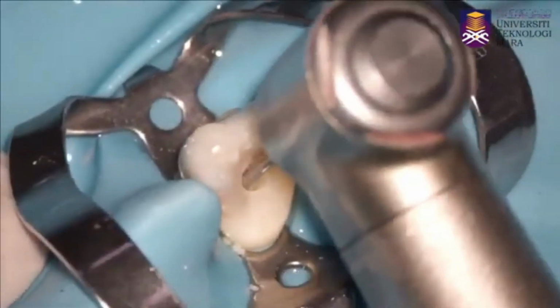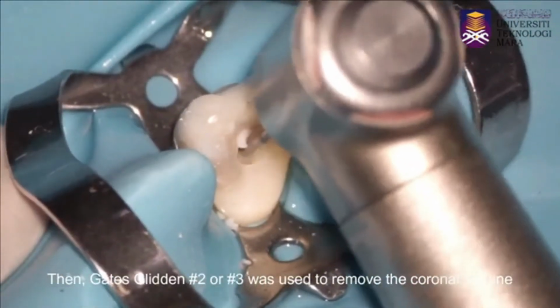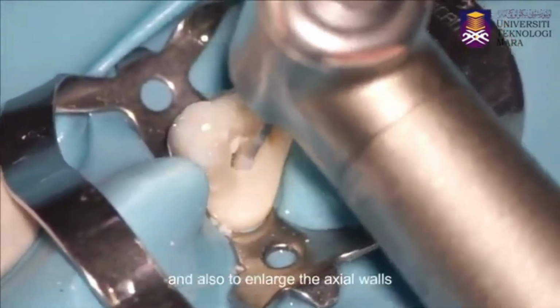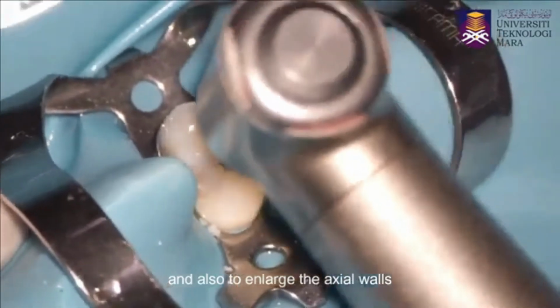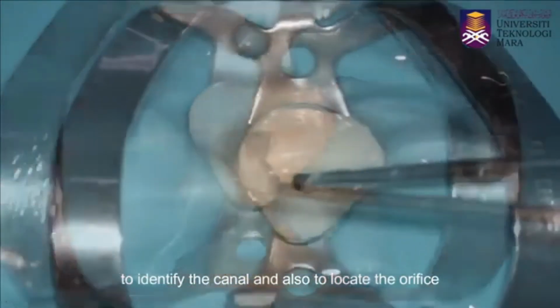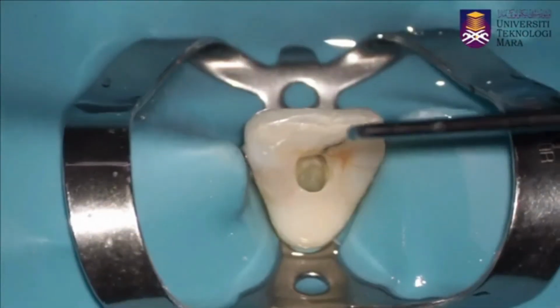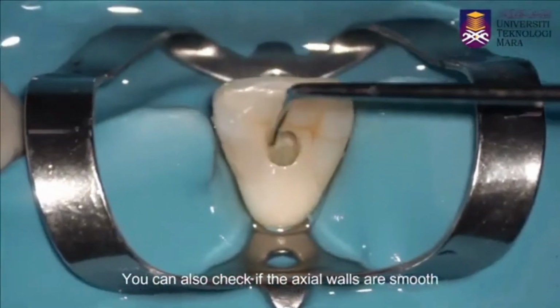The outline form of the access cavity of the maxillary central incisor is a rounded triangular shape with the base facing the incisal aspect. The shape may change from triangular to slightly oval in a mature tooth because of less prominence of the mesial and distal pulp horns. For the maxillary lateral incisor, the shape of the access cavity is similar to that of the maxillary central incisor, except it is smaller.